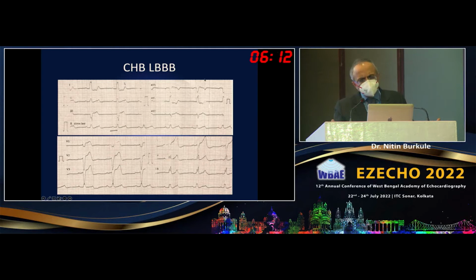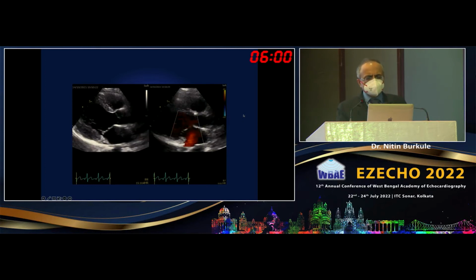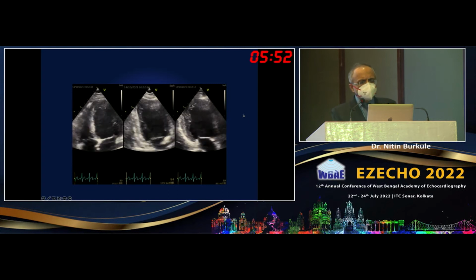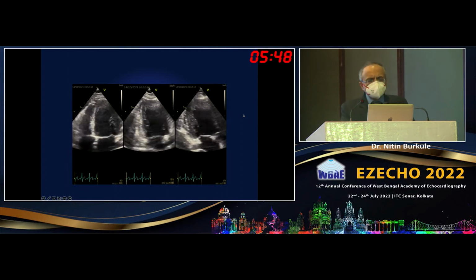When you know this kind of person with a viral illness then has tachy and bradyrhythms, definitely you are dealing with myocardial inflammation. Now this is the echo, which shows a mild LV dilatation and some LV dysfunction. This is not a 16-year-old's LV, you know there is definitely a dysfunction. EF visually looks like 40% or so. So let us look at his MRI.